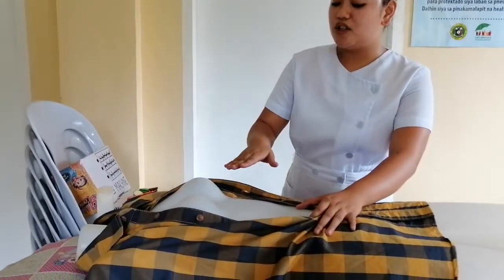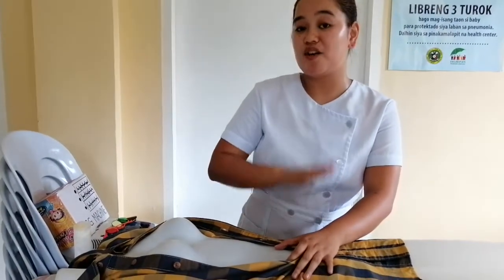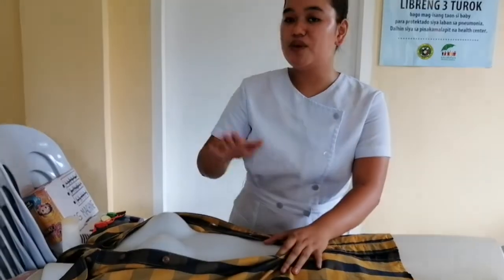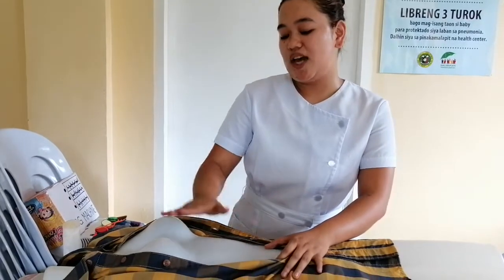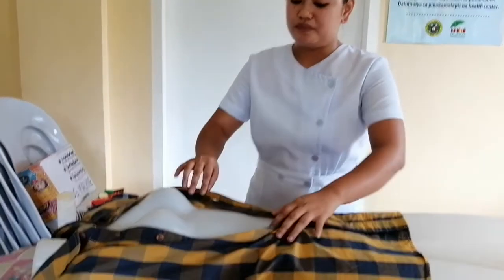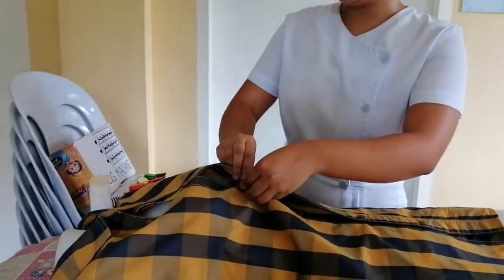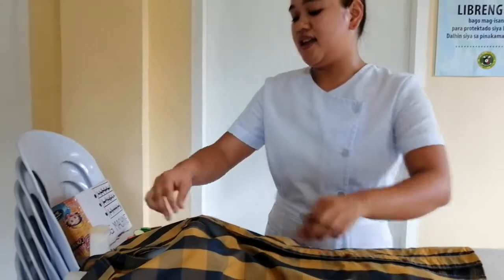Also if the client has cuts, wounds, nodules, masses, or breakdowns on the chest area, and areas of irritation. Okay? Everything is okay. Ma'am, i-close ko na po. After inspection, you also need to reclose the clothes of the client.